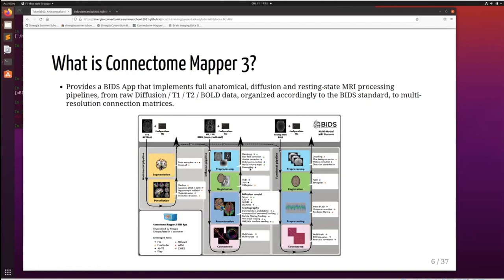Partial volume maps help tractography refine fibers and reach the cortical surface. The registration stage provides FSL FLIRT linear registration, ANTs nonlinear registration, and surface-based registration via BBRegister from FreeSurfer. On the reconstruction side, different diffusion signal reconstruction algorithms are available depending on your data type: the tensor model, constrained spherical deconvolution, spherical harmonics, SHORE, and MAP-MRI, which can also provide microstructural information.